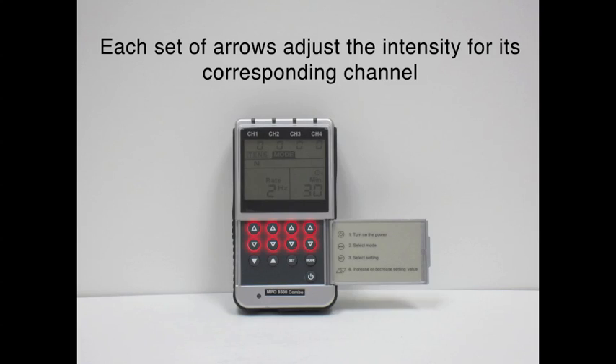Open up the device and here is where the controls are. You'll notice that there are four up arrows at the top and four down arrows. This will help to increase and decrease the intensity of the channels for the impulses. There is also an up and down arrow to help you change the settings of the different parameters, then your mode button to get through all the various modes, the set button to help you change the parameters, and the on/off button.